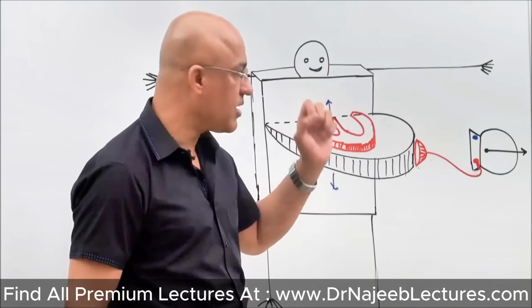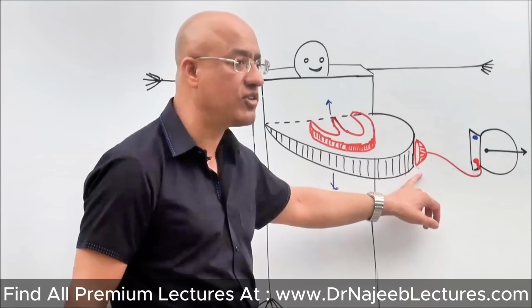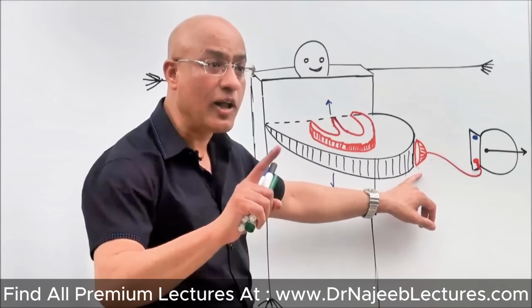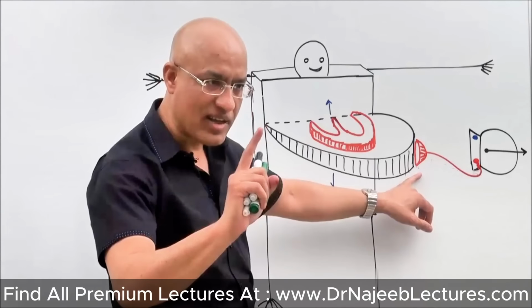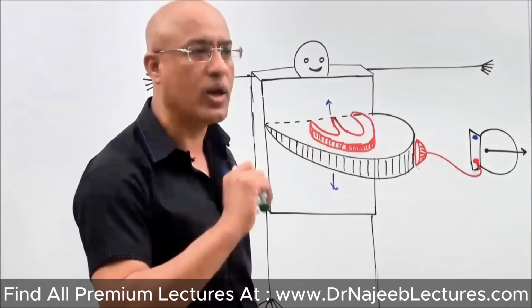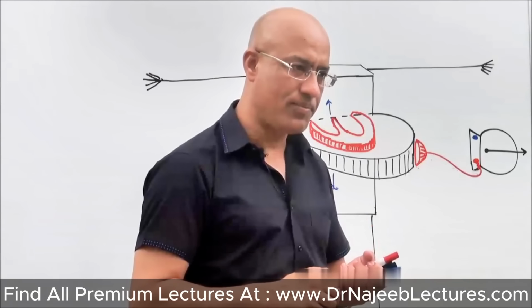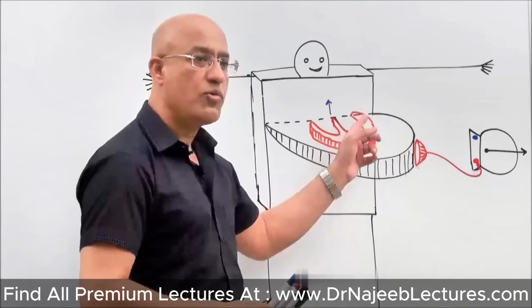You must remember that chest leads are unipolar leads. Don't say chest leads are unipolar limb leads. Unipolar limb lead is a different story. But chest leads are also unipolar leads. It means they must have one exploring electrode and one indifferent electrode, which can also be called the near zero electrode, null electrode or reference electrode. Now, how do we construct the indifferent electrode for the chest lead?